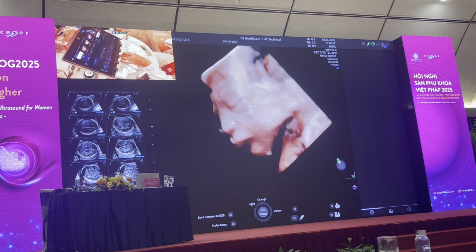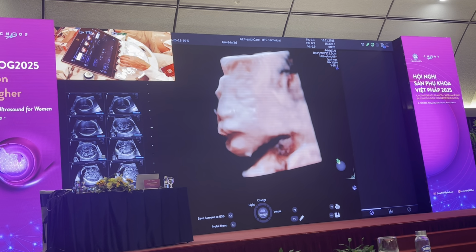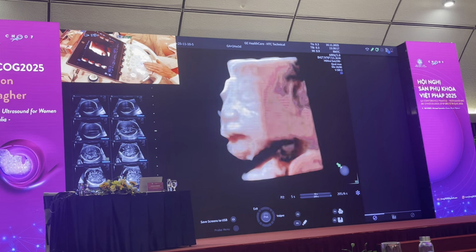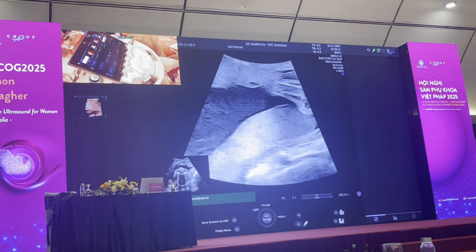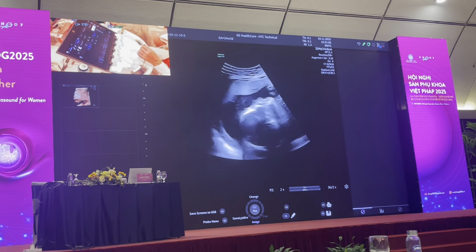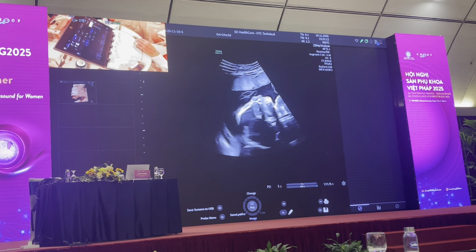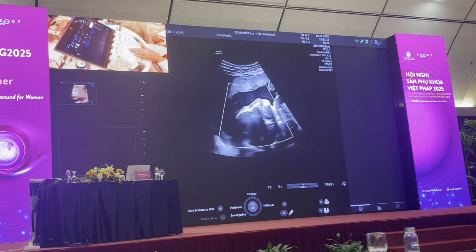Again, when you're using the edit light function on the baby, remember that that angle is getting the light around from 2 o'clock over to 11 o'clock. I'll save that image to disk. I'm going to do one more volume just to try and get a better position. But as I look at that now, I can see that there's a mild degree of micrognathia.